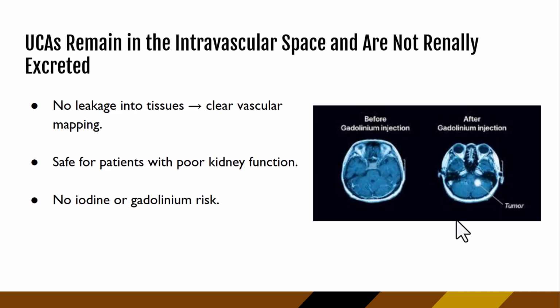But again, the really big part of this too is that gadolinium and the iodine-based CT contrast agents actually do carry along some risks for the patient, especially nephrotoxicity. And the UCAs don't carry along that risk. So if we have a patient that cannot have contrast under MRI or CT, ultrasound contrast is a really great option for them.